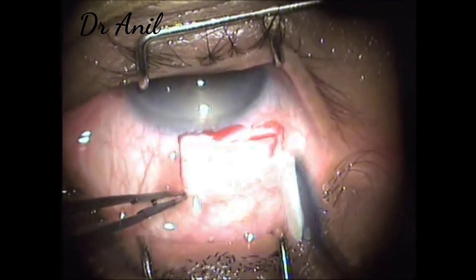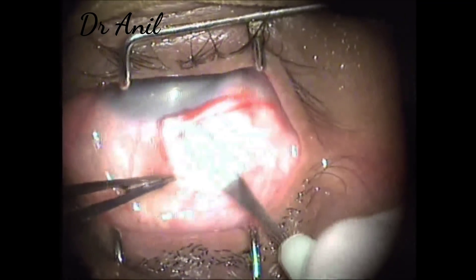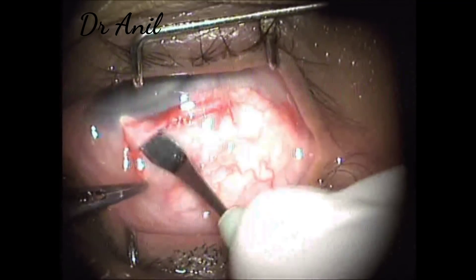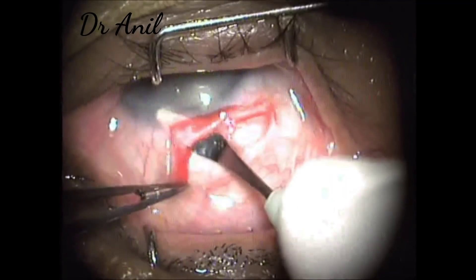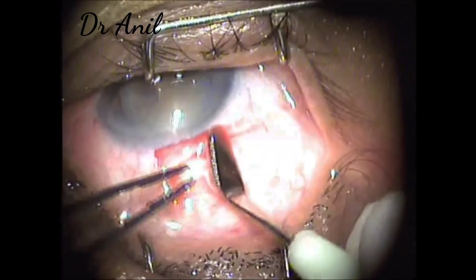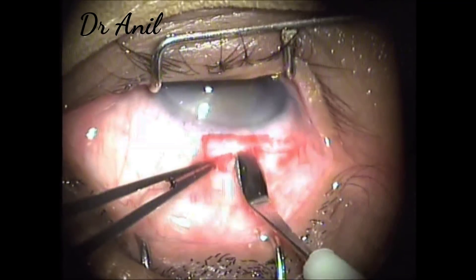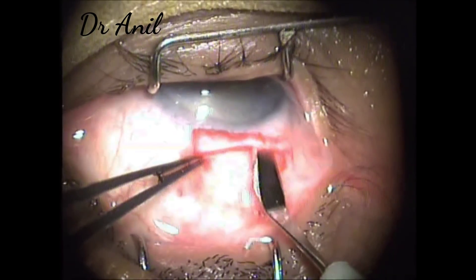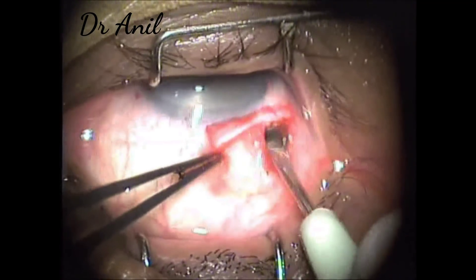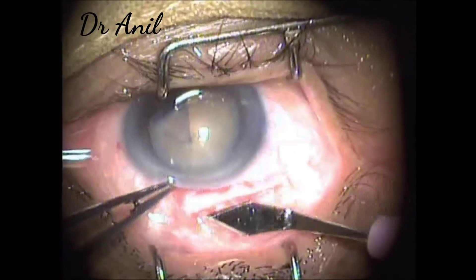With a crescent blade, I sweep a little all around first, then start progressing towards the cornea from the left side of the tunnel. Just try to pull it on the left, completing the left side of the tunnel. Three sweeps will be made so that the tunnel is complete — the first one, the second one, and the third one completing the tunnel. Then we try to make the right side of the tunnel complete, just near to the side port.